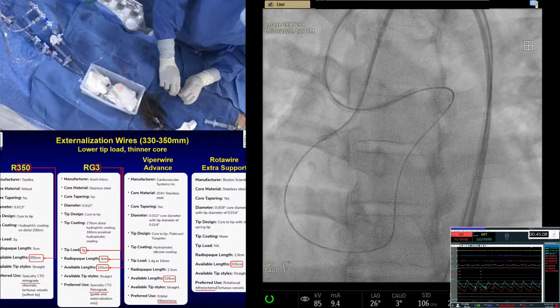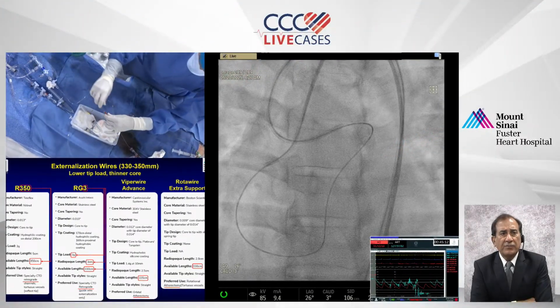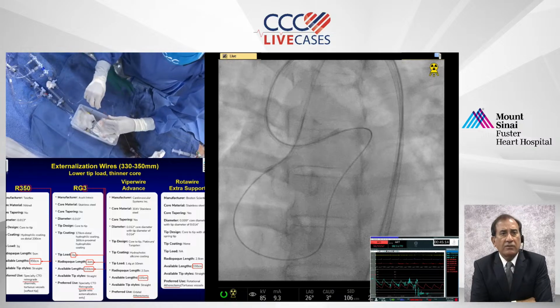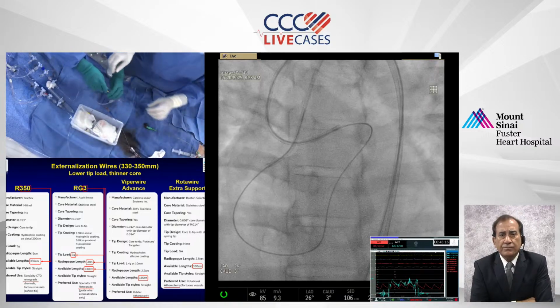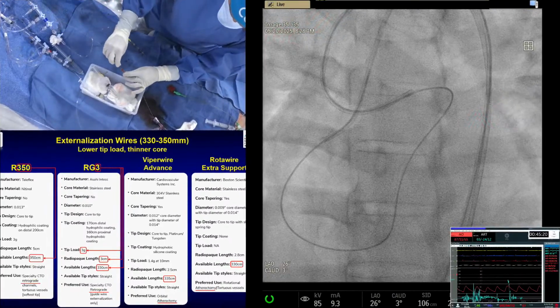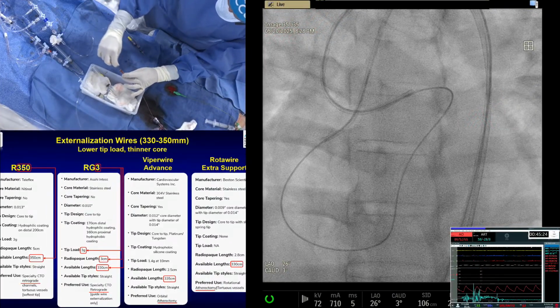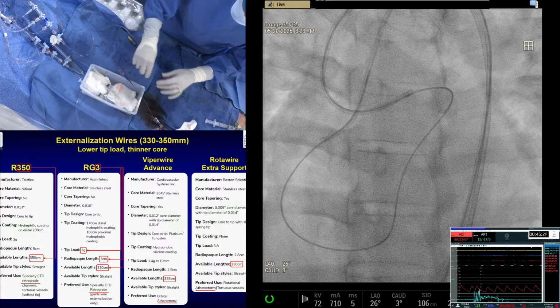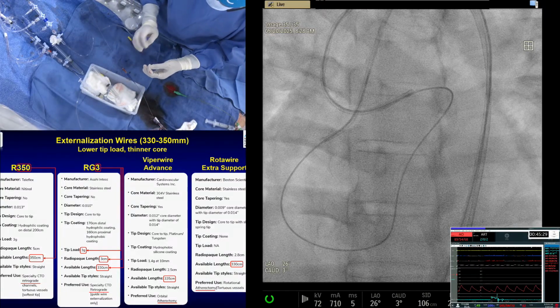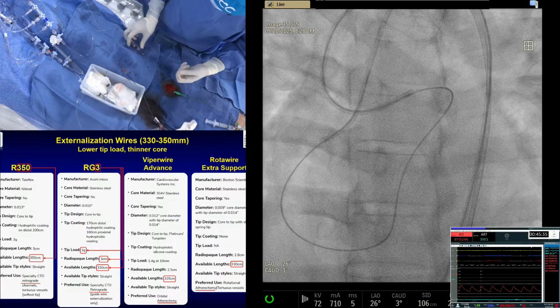Another question for you: sometimes do you do a CTA before attempting complex CTOs? Yeah, very good point. A lot of people do, but we are not big believers of that, and we have never done it. Some people will use imaging, IVUS guidance. There are some data plus minus. Some people are big believers of IVUS, but we have not been taking that approach.